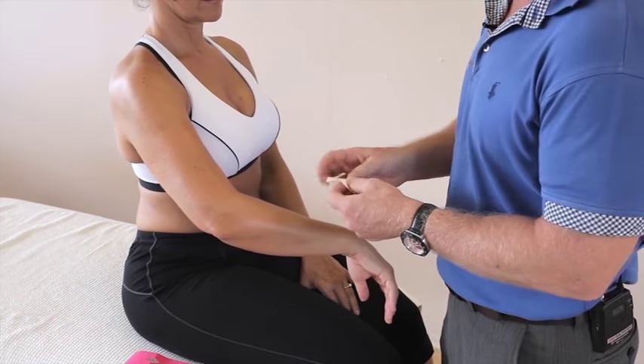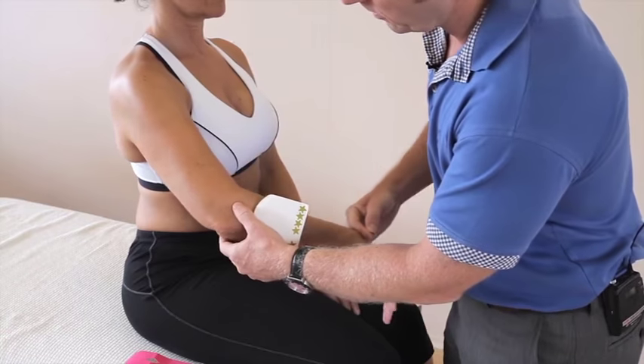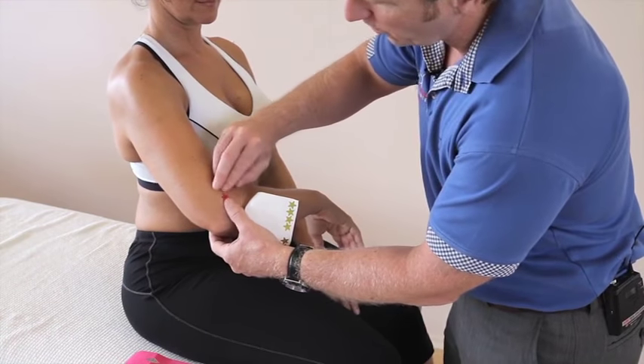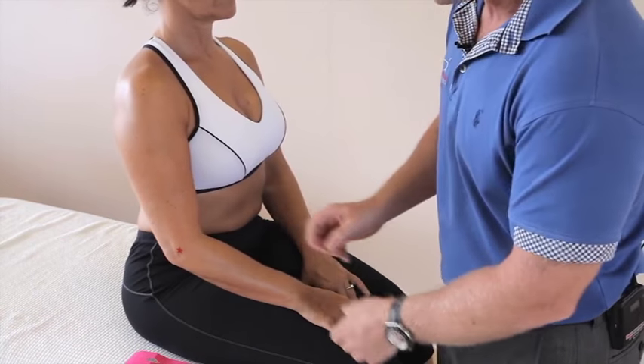I'm just going to mark where the pain is with a sticker on this lateral epicondyle. Just bend the elbow for me. So if you've got pain on that area, kinesiology tape works very well.